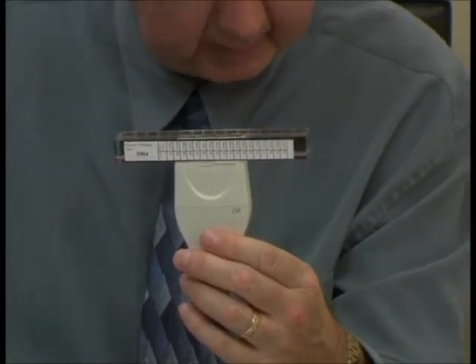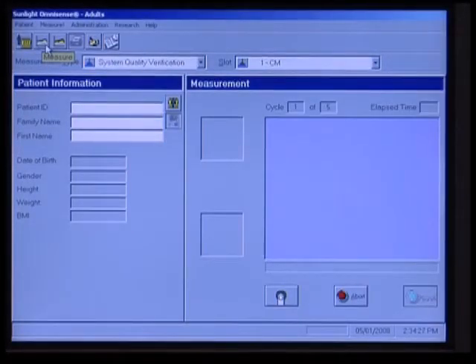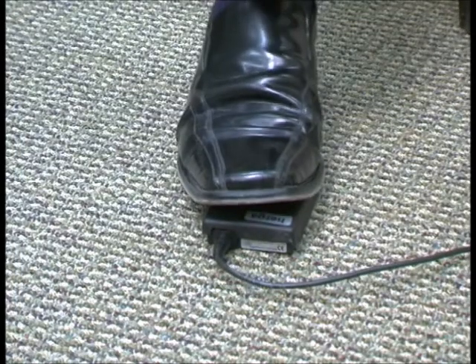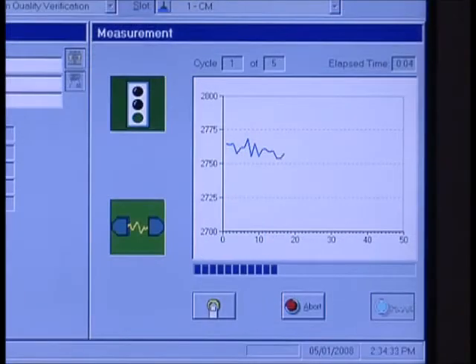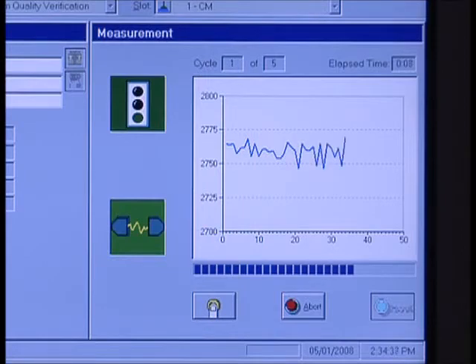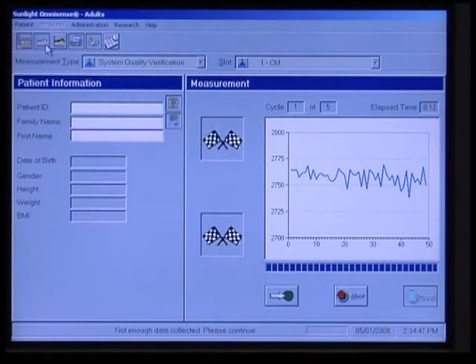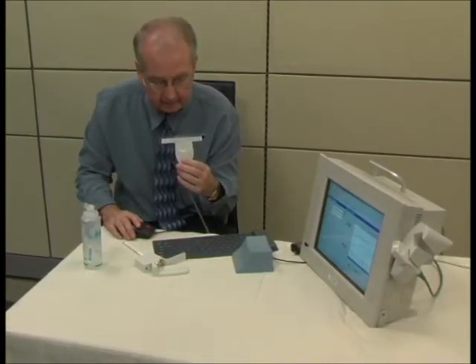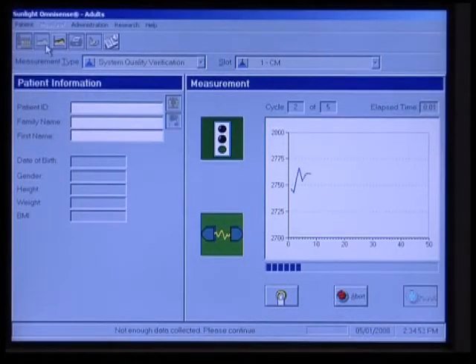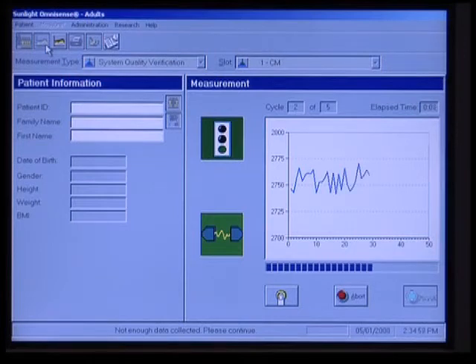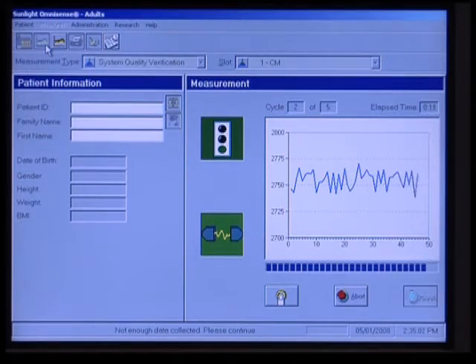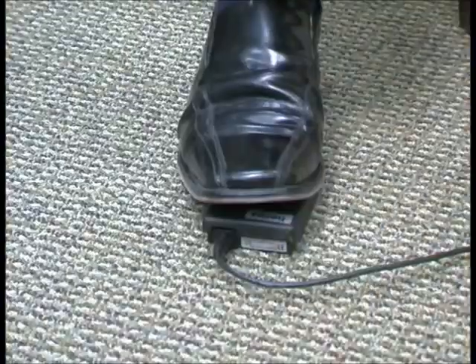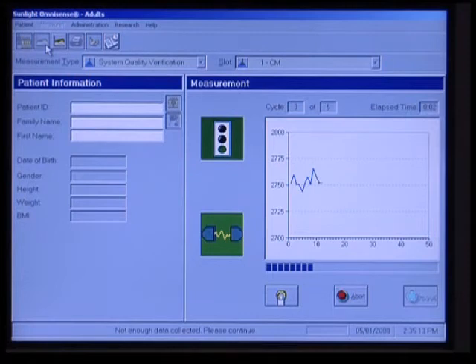Now we're going to click on Measure. We're ready to measure, and I'm going to hit the foot pedal — that starts the test. You'll hear an audible sound until the test is finished. We have a checkered flag, which means we need to do another cycle — you'll see it says cycle one of five. Usually we're okay with three cycles, but we have to do another. I'll hit the foot pedal again to start a second cycle, then continue through to a third cycle, which will hopefully be enough for the unit to get an appropriate measurement.